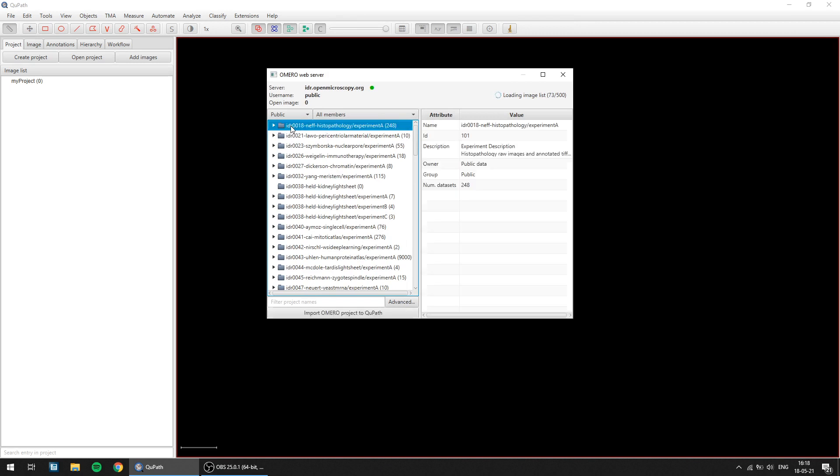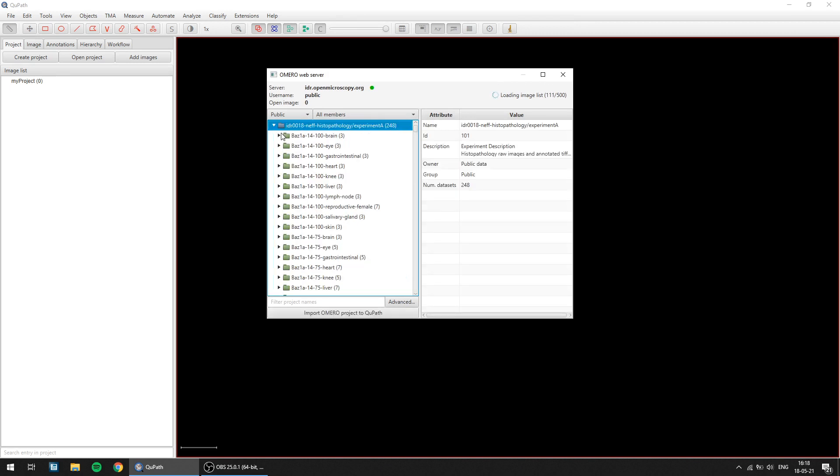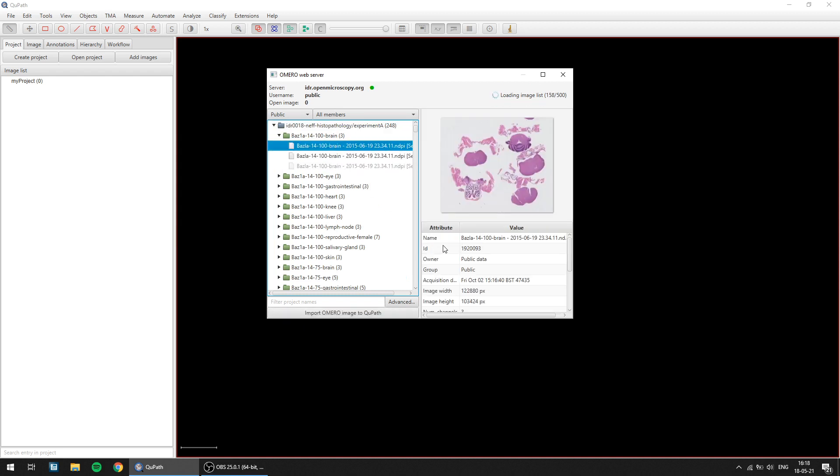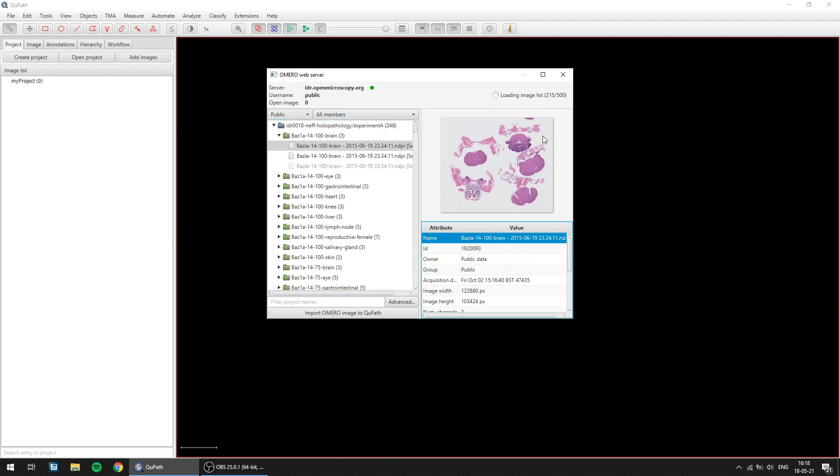So you can browse all the projects that you have, the datasets that you have, click on the different images that you have. Every time you'll get the information relating to the image selected on the right side, as well as the thumbnail here. You can filter project names, you can also filter them by groups or by owners.